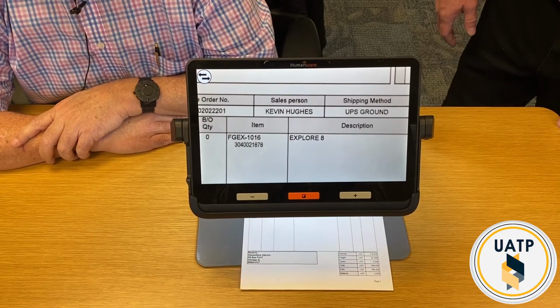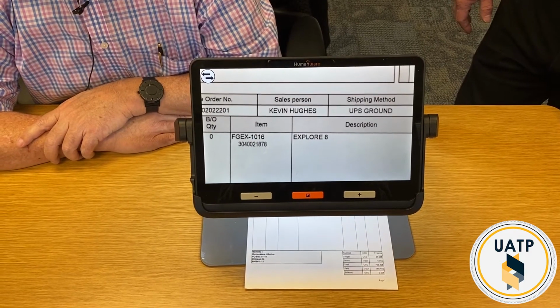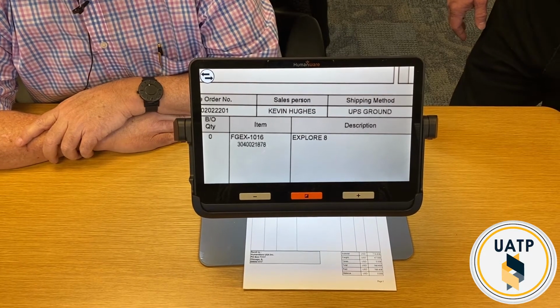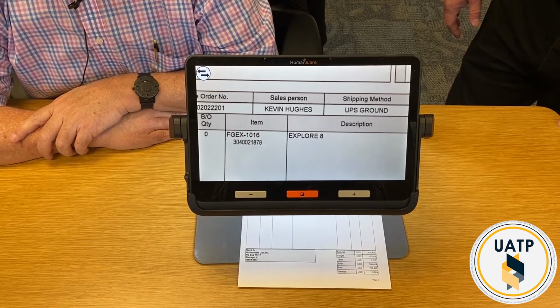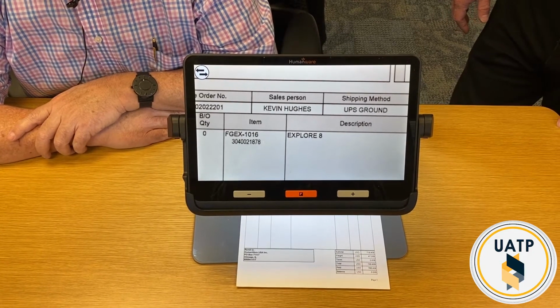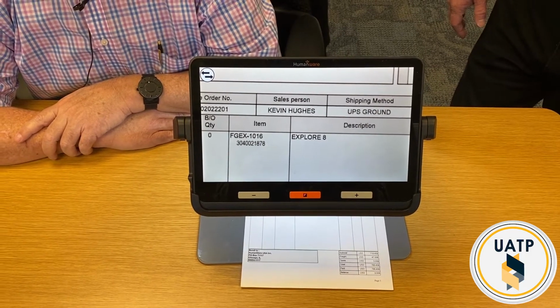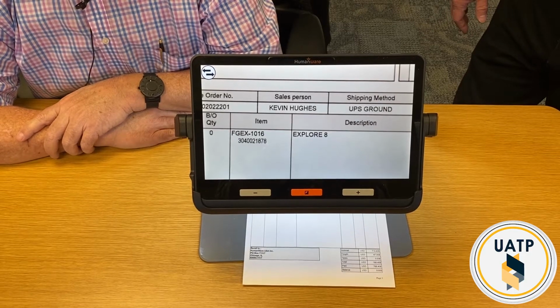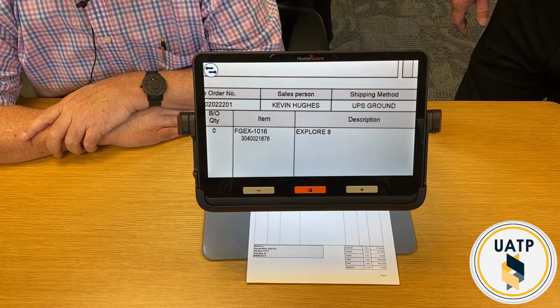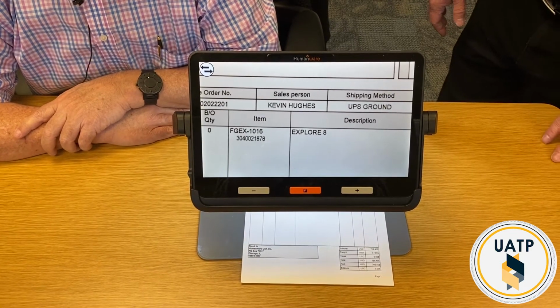It's interesting because I always think that blind people have this problem or low vision people have this problem, but I was talking to a friend of mine a while back who has normal vision, and he said, yeah, the manuals that we've been getting, they print them in very light print on a kind of blue background. He says, I prefer to read the version online because I can't hardly read that print. And that's a person with normal vision. So I think sometimes they get things that look nice, but they aren't as easy to use. So that's what this device has decided to do.